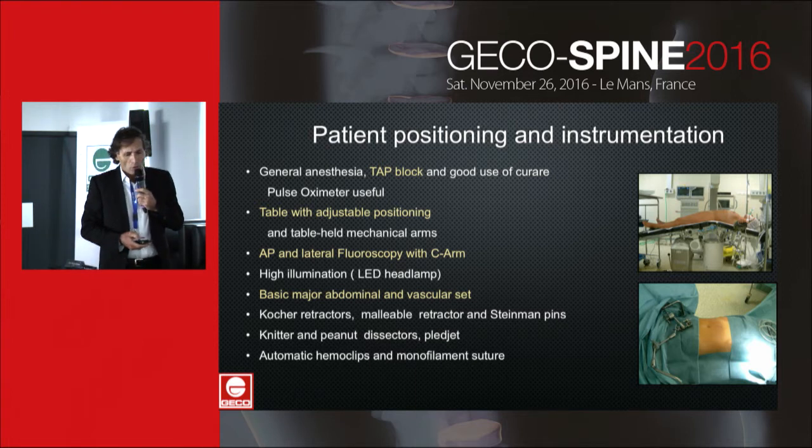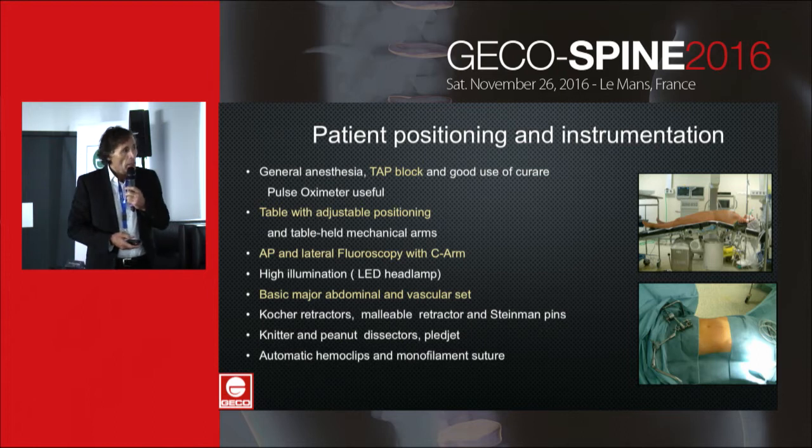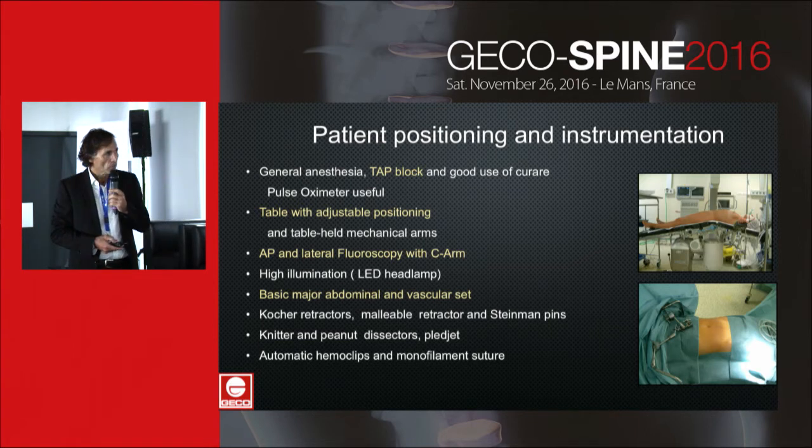We always use a transverse abdominal plane block before incision for patient comfort and post-operative pain management. You can see the installation with adjustable positioning and table-held mechanical arms. It is necessary to be careful with hyperlordosis, which increases the tension on the vessels.